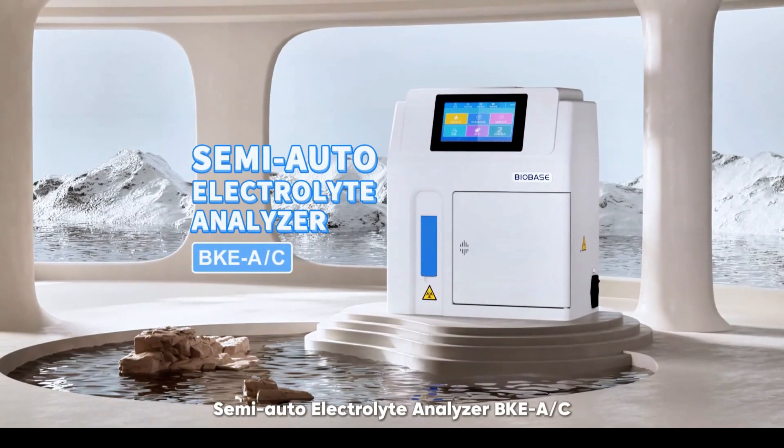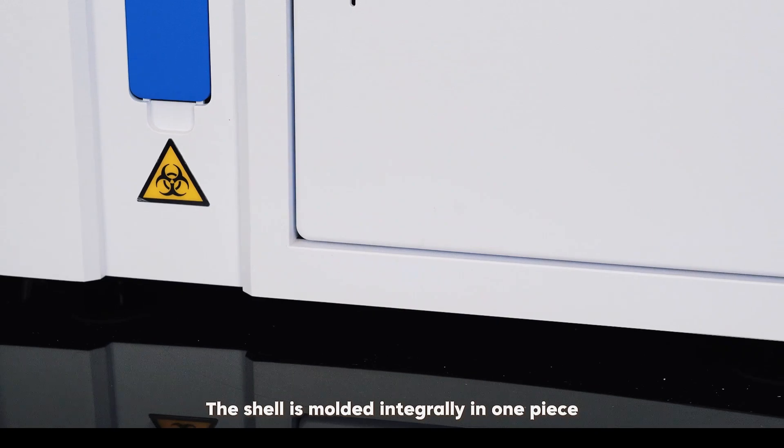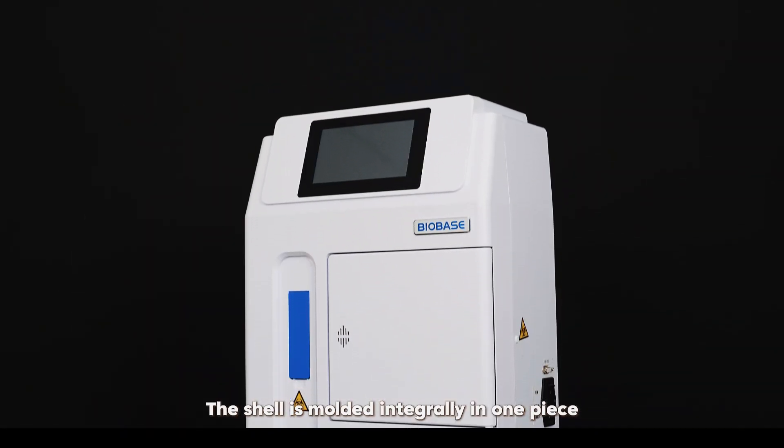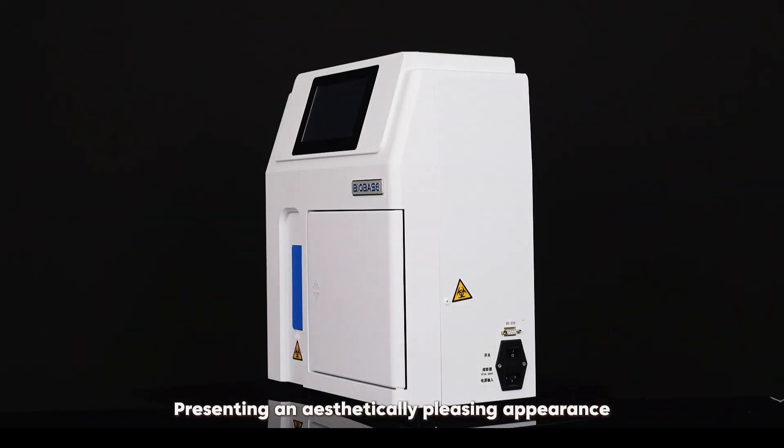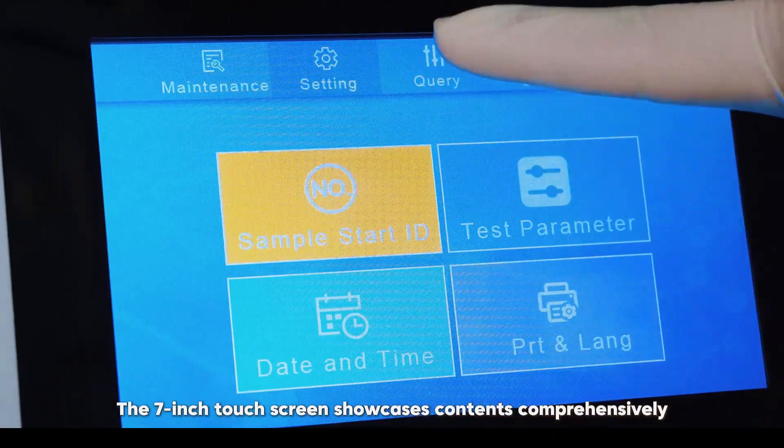Semi-Auto Electrolyte Analyzer, BKE AOC. The shell is molded integrally in one piece, presenting an aesthetically pleasing appearance. The 7-inch touchscreen showcases contents comprehensively.